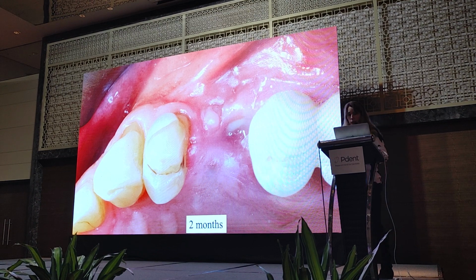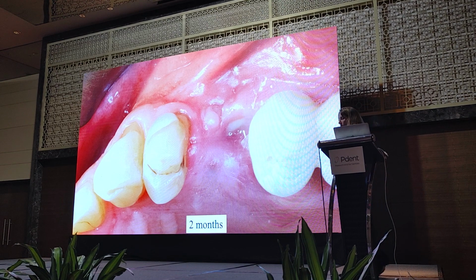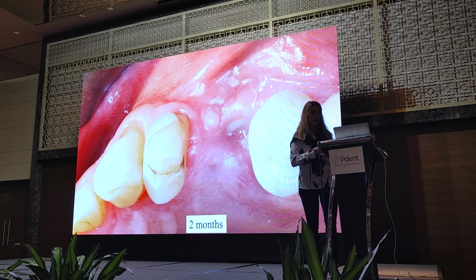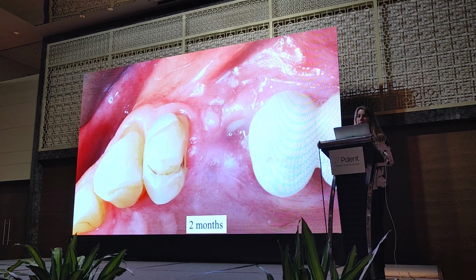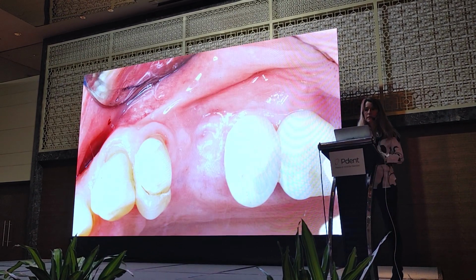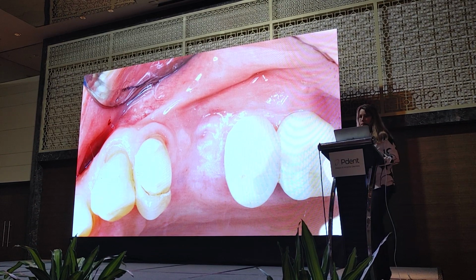I said, okay, we open again. And the bone was all white. No bleeding, osteitis. So I removed all the white bone, all the dead bone. And finally, after 2 months, I have a healthy healing. Great.